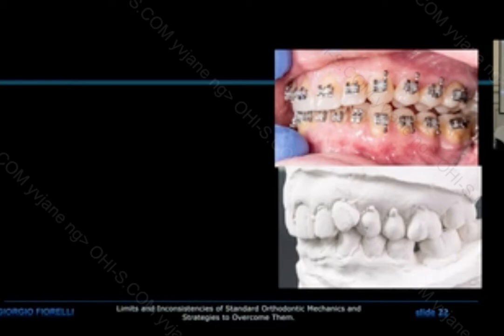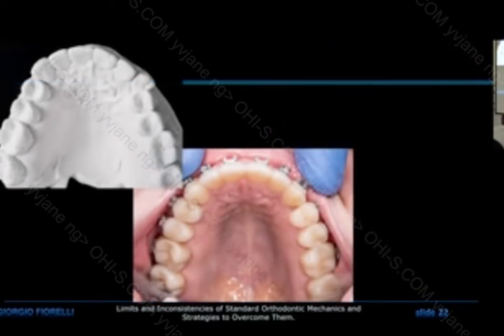But you should always be aware that our patients many times don't need to move all the teeth. Most of the time, we need to move selectively some teeth, and other teeth don't need any movement. And so in that case, just using an alignment wire is going to produce troubles. Small troubles that we have seen in the first two cases, so you can say, okay, I don't care, and it's understandable. Or more complicated things.